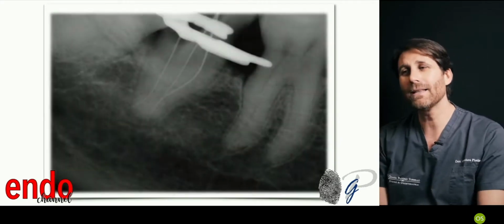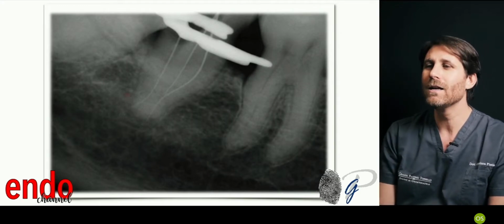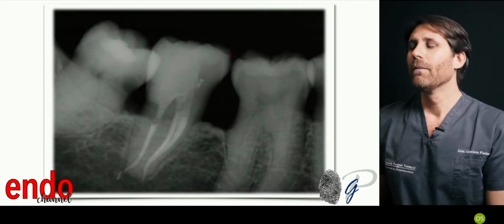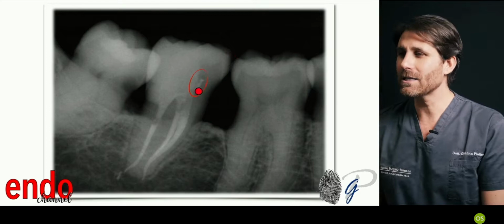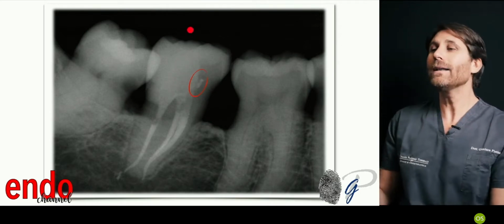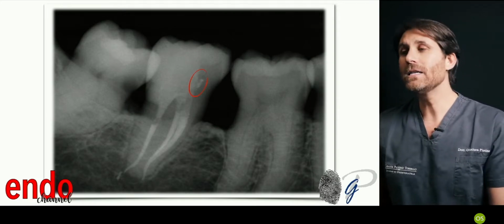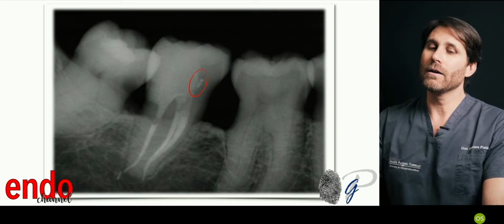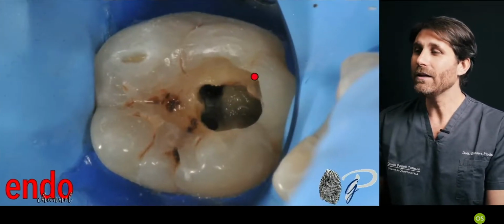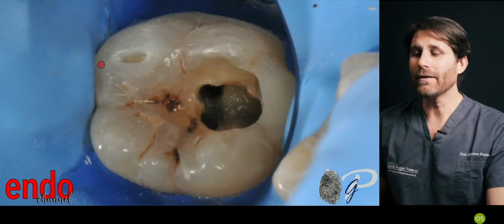But you can apply the same principle even in a case like this with a double curvature, confluent canal, curvature in the distal canal. I tried to maintain this concept, maintaining the pulp horn in the mesial aspect, maintain the pericervical dentin there, while sacrificing the already lost tooth structure. In this case, obviously, it is more difficult because it's difficult to go inside this cavity in a first or second molar, because you have to enter from the mesial aspect.